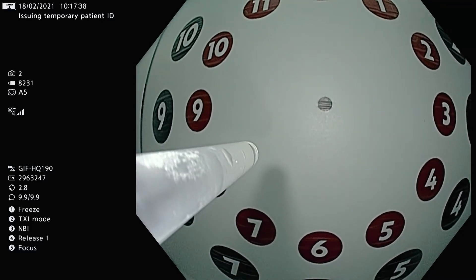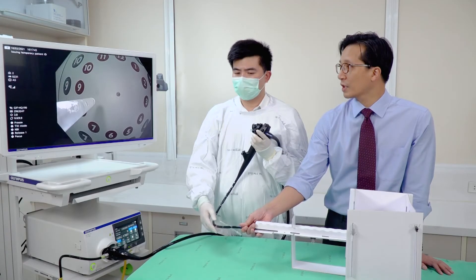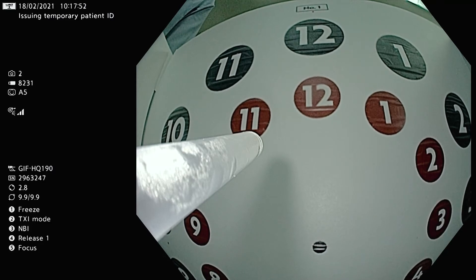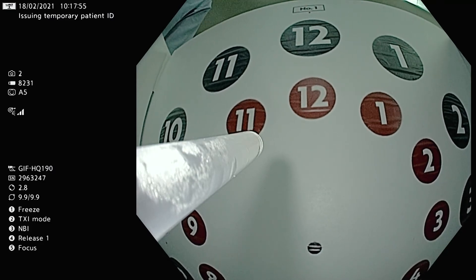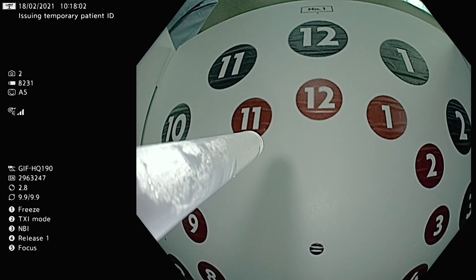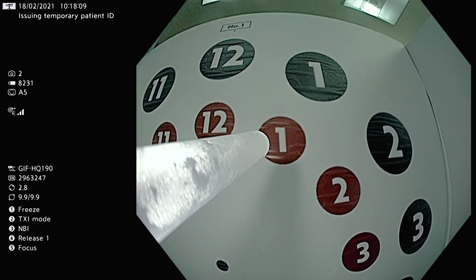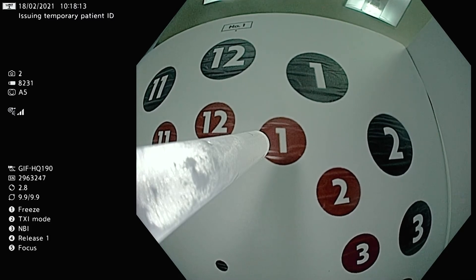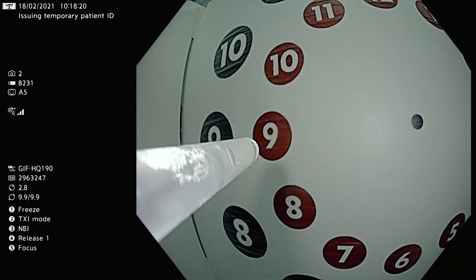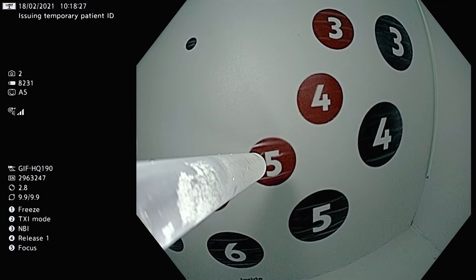The next exercise is: once the trainee is used to moving with torquing, you fix the scope with an assistance hand with 12 o'clock at the top, and then you force the trainee to just use their left hand to manipulate the large and small wheels. You can call out a number — for example, one red — and the trainee is then made to point to that spot. Then you can call out any other number at random, such as nine red or five red.